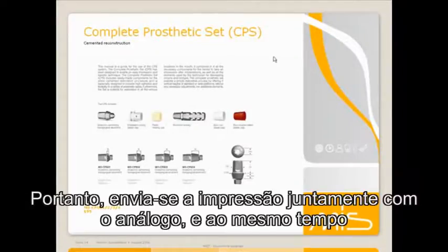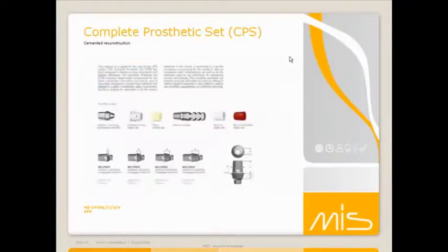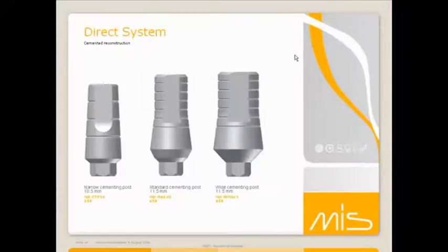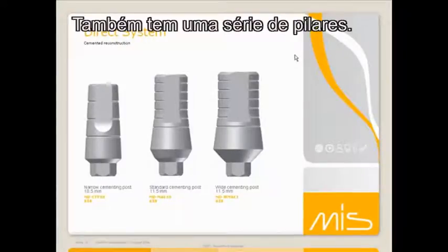Now, again, you're going to send the impression along with the abutment analog, and at the same time, you're also going to send those two, the red cap and the white cap at the end there, to the lab. Those are burnout caps for the lab. The red is going to be engaging, the white is going to be non-engaging. Basically, those are for cases when the lab is going to do it, whether it's a multiple or a single case. We also offer a full line of abutments.